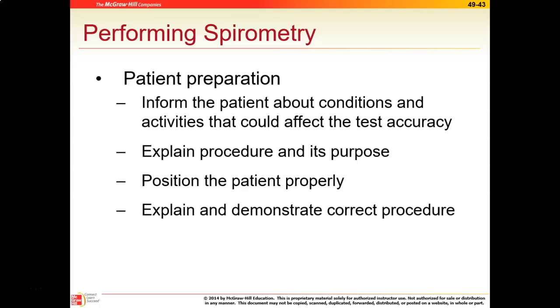Certain serious medical conditions, like a recent heart attack, you'd probably hold off doing this test. And then certain medications, if you're doing a pre and post test, you would not have wanted them to utilize their asthma inhaler, usually 4 to 6 hours before this test is done. Because the idea would be to test them at whatever their normal is, and then give them the medication and see how well they responded to that medication. Okay. Sedative and opioid usage can affect this because those particular medications can inhibit respiration or cause problems with breathing.